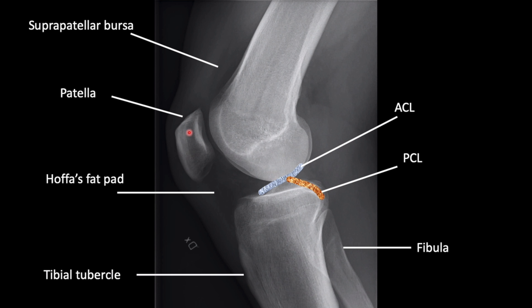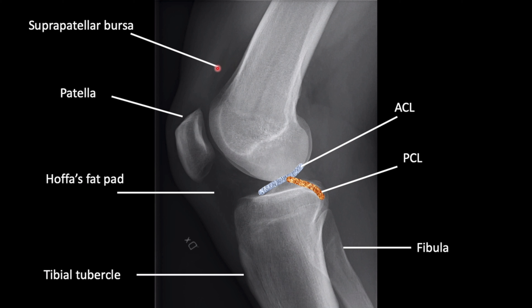On a lateral knee radiograph you see the patella, femur, tibia, and fibula. Superior to the patella there is a thin structure of soft tissue density sitting between two low-density structures. This dense structure is called the suprapatellar bursa. When there's a fracture or a knee effusion for any other reason, this is the first structure that gets swollen up. If this structure is more than five to ten millimeters, we call it a knee effusion. The dark structures are the pre-femoral fat pad and the suprapatellar fat pad. This is Hoffa's fat pad, the tibial tubercle, fibula, and you can see the ACL and PCL here as well.